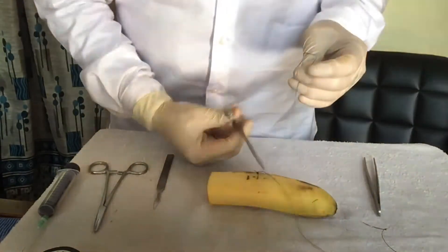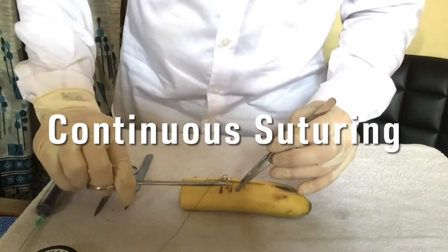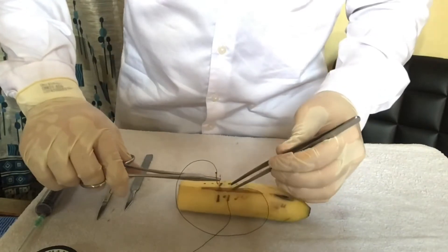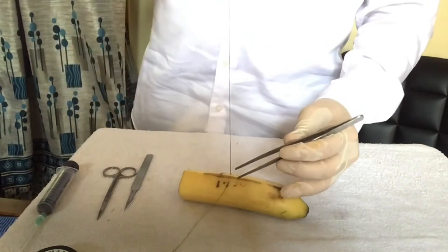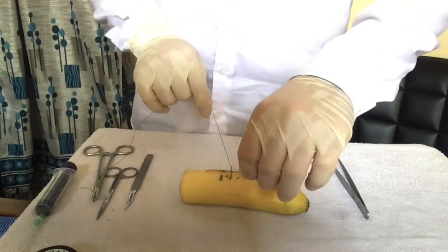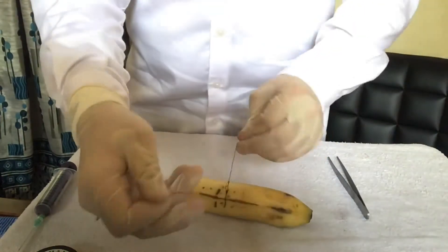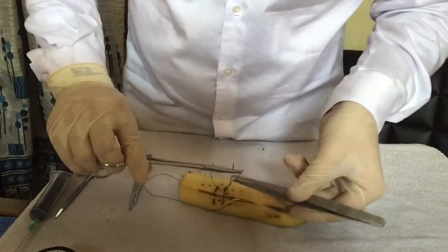Now cut the extra thread from the suture — the simple interrupted suture is done. For continuous suture, insert the needle the same way as the simple interrupted and tie a knot. Here I am doing hand knot tying; you can also use the needle holder for tying the knot as done previously. Tie the knot at least three times to make it strong.